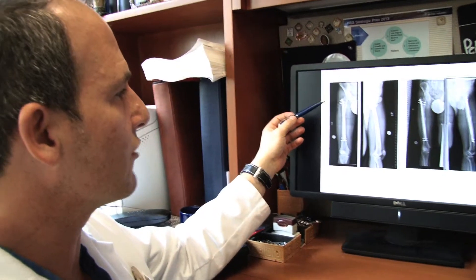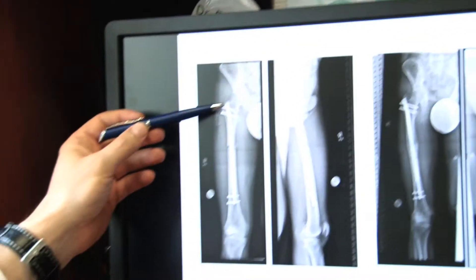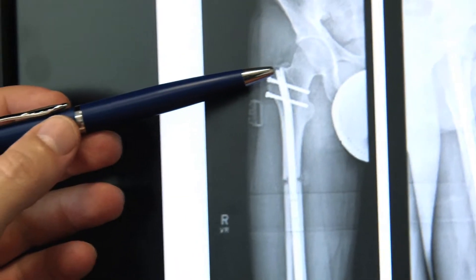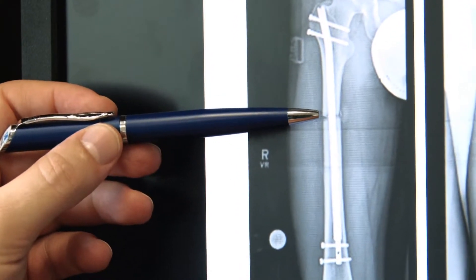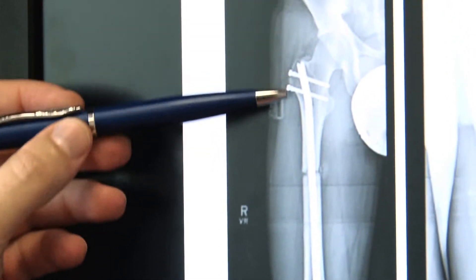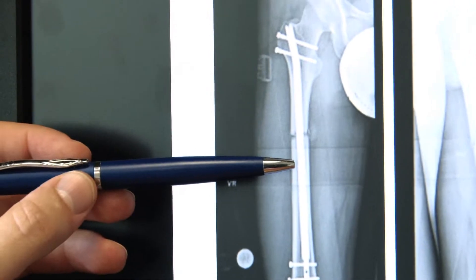I'd like to show you some images on my computer screen. This is one patient who underwent a lengthening, and what you're seeing on this set of x-rays is a front view of the femur. The rod has been inserted through the top of the femur. This is the osteotomy, or the bone cut — this is right after the lengthening, before any real distraction has been done. These are the locking screws that hold it in place. This is the magnet within the nail.